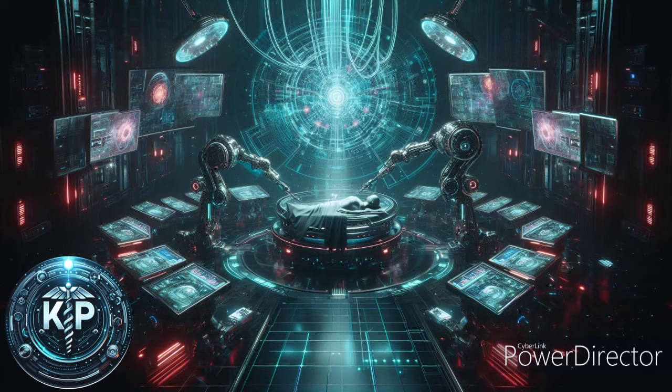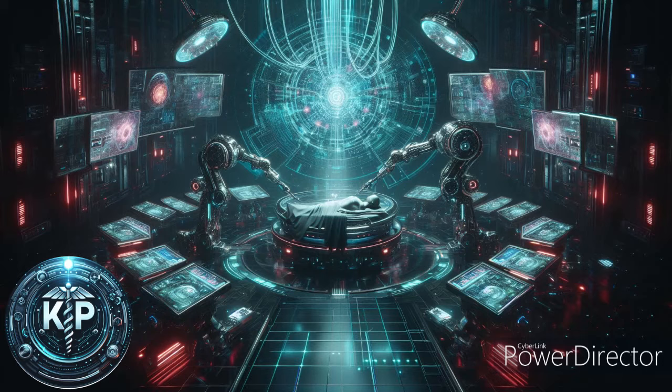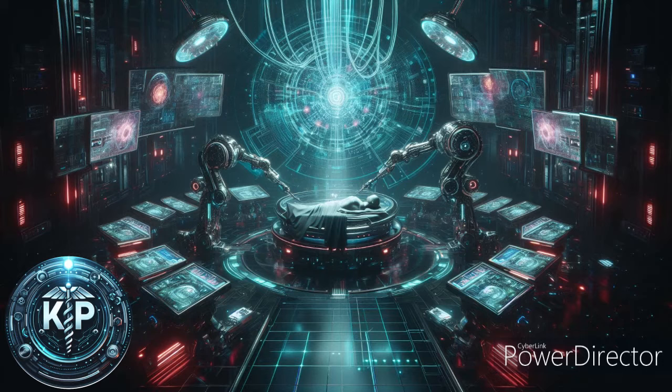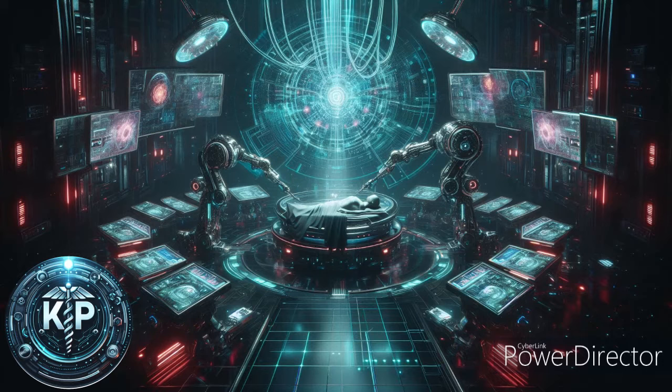The integration of advanced technologies like augmented reality (AR), artificial intelligence (AI), and machine learning further augments the surgeon's skills.